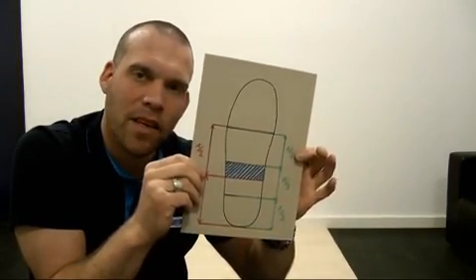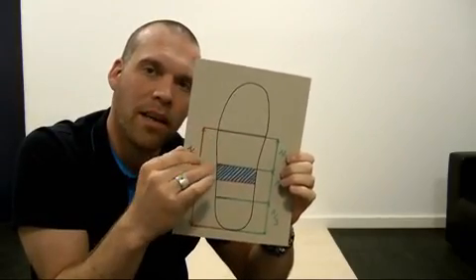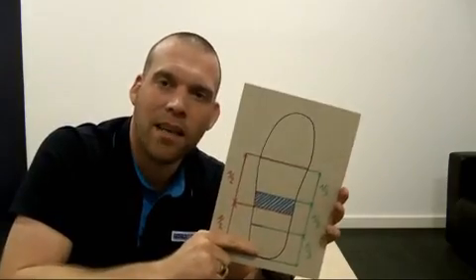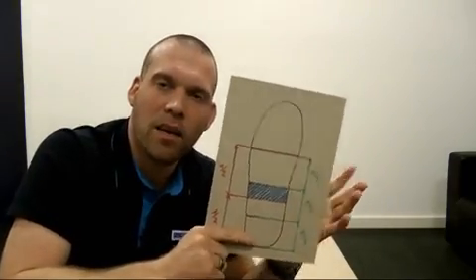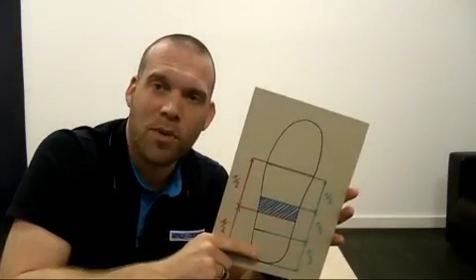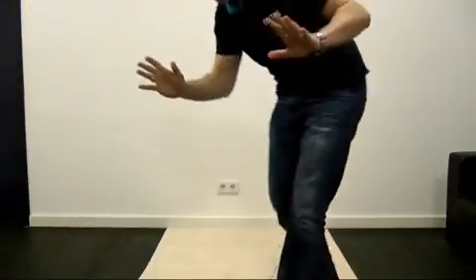As said before, we have divided the forefoot area, the forefoot lever, and the heel rocker lever arm into rather ideal ratios, which is certainly good for the dynamics. However, we would like to explain to you once again with another example what this means for the statics, so the term stability takes some form.